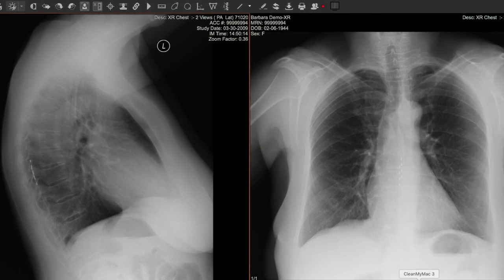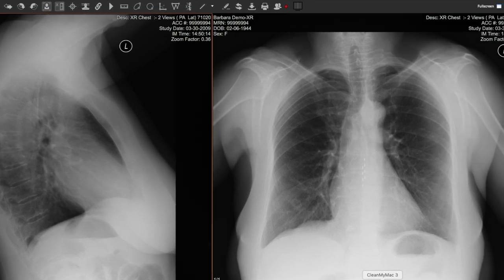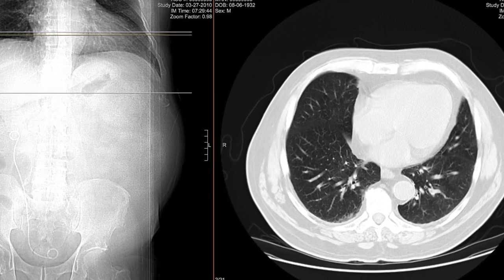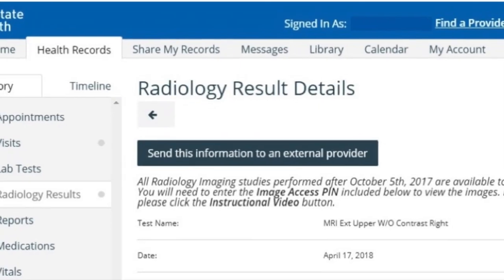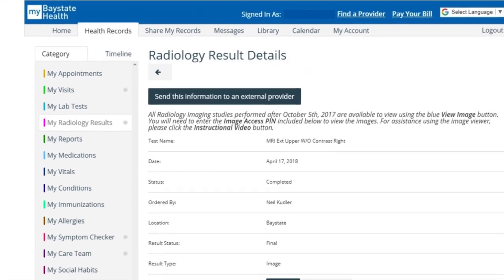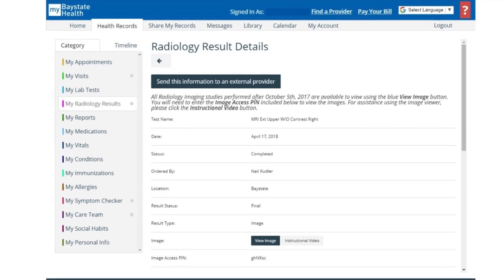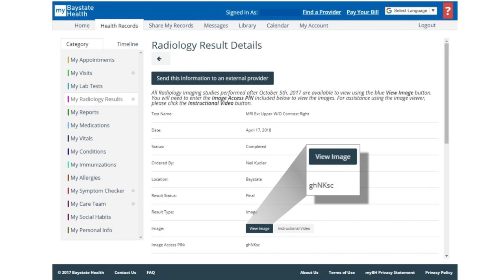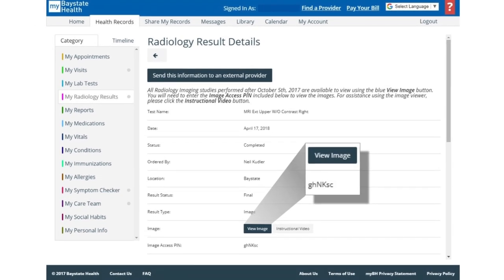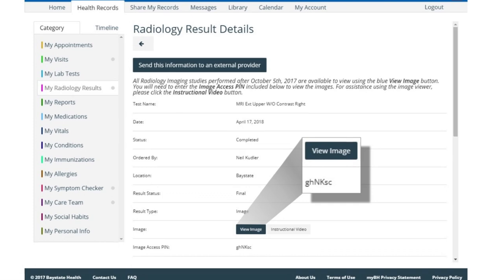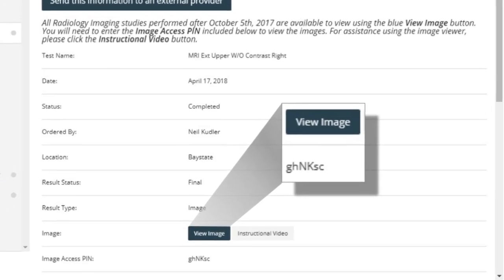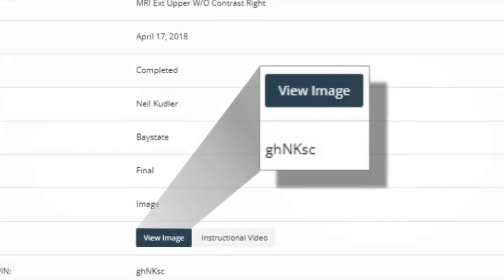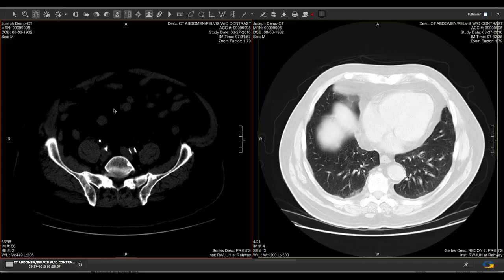My Bay State Health now allows you to view your medical images easily and securely. When you navigate to My Radiology Results on the Health Records tab, click on the View Image button. You will be asked to enter a unique PIN code that is displayed directly below that link, after which your imaging study will be loaded into a pop-up window on your browser.